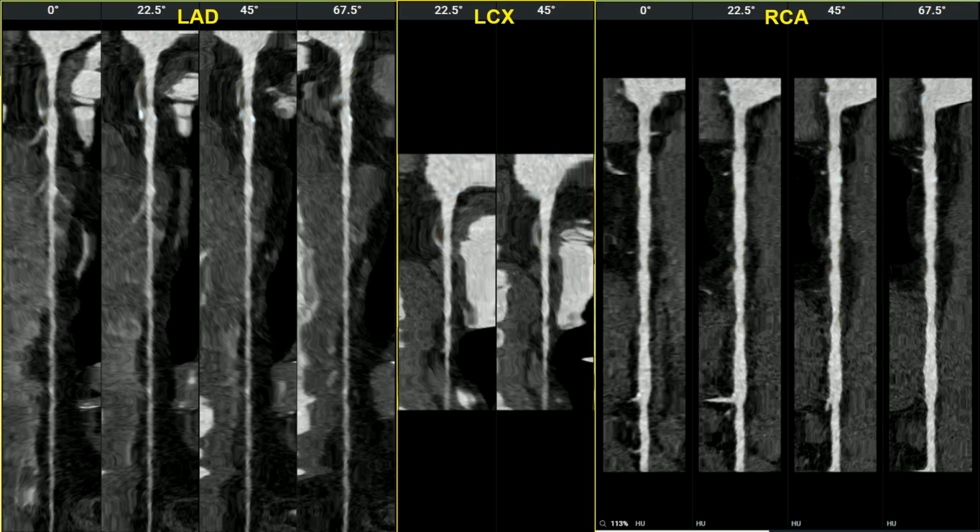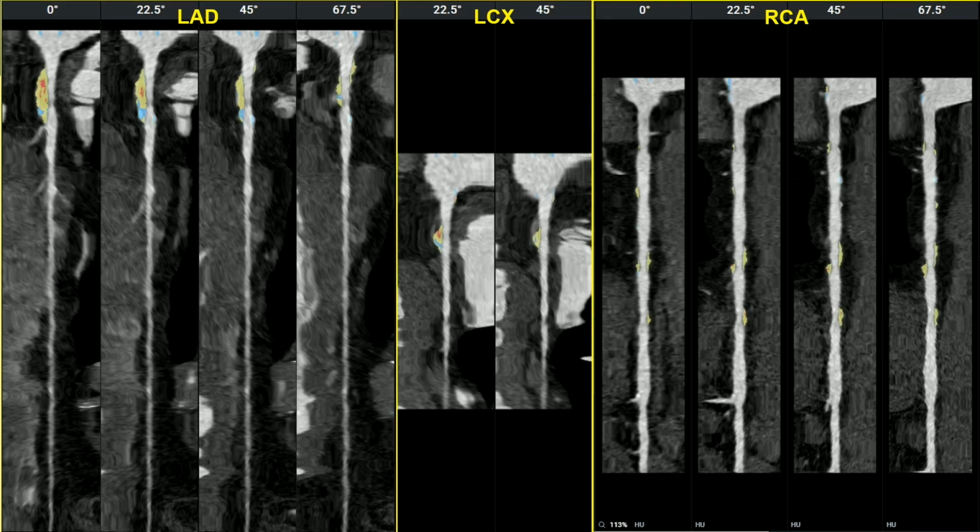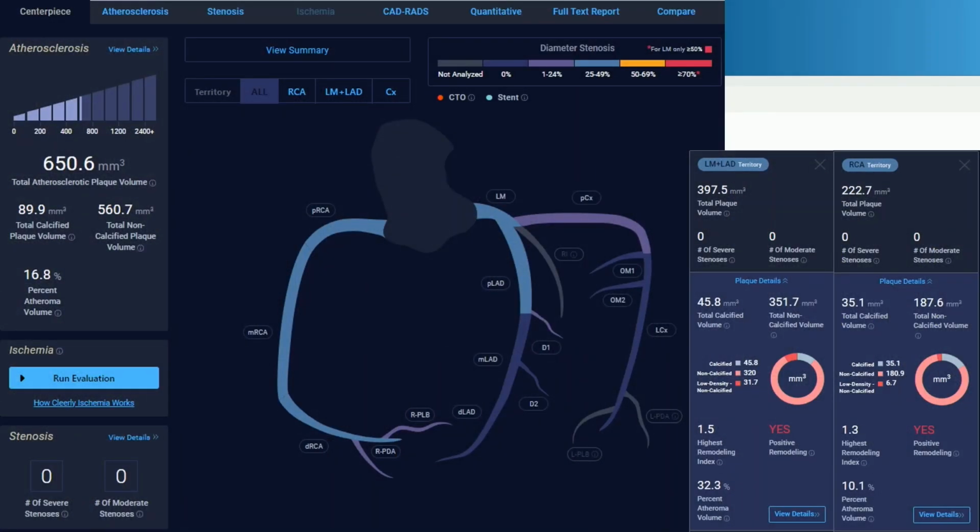This is pretty typical for our experience, which is wherever on the display my eyes are seeing the plaque, the plaque overlay covers the areas where I see the plaque. So, another compatibility between what we're seeing and our own clinical impression.